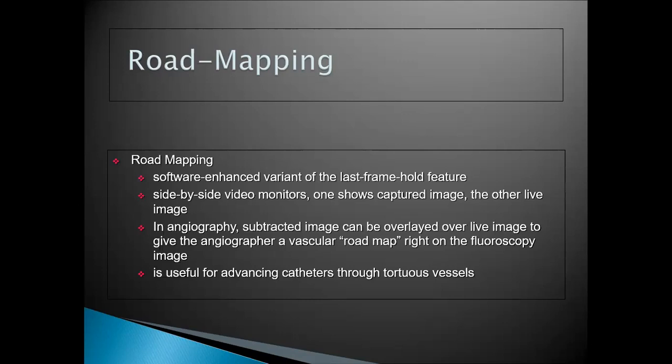At every point in time, we see our last image, and we also continue to see on the video monitor how whatever we are doing is advancing, maybe the catheter, or in radiotherapy, how the radioactive seeds are being implanted into the body. In angiography, a subtracted image can be overlaid over the live image to give the angiographer a vascular road map on the fluoroscopy image.